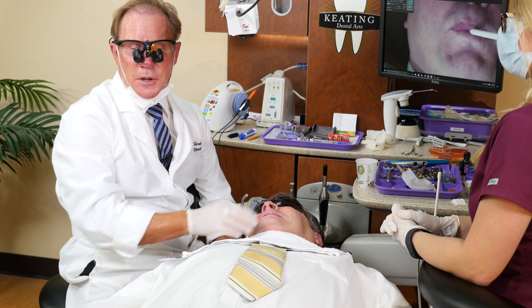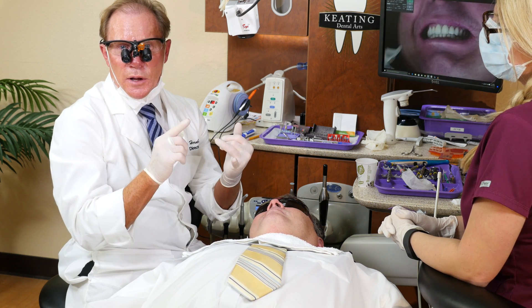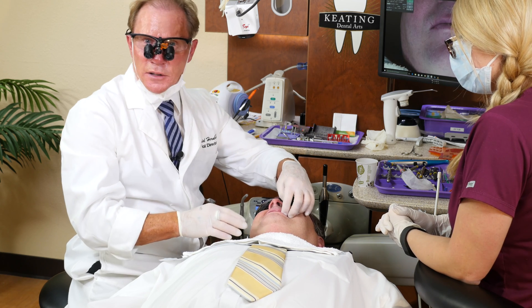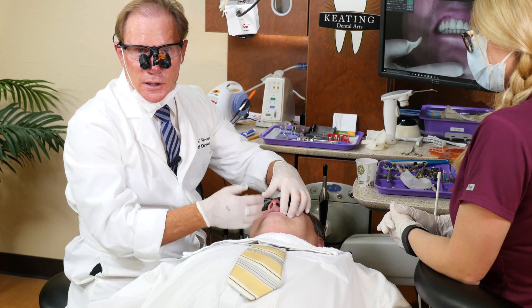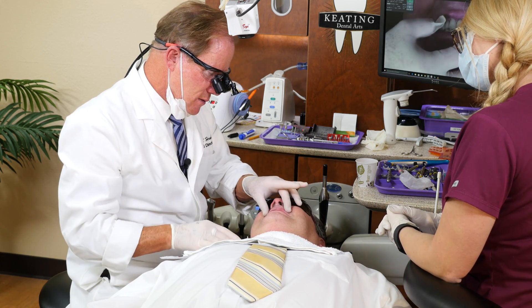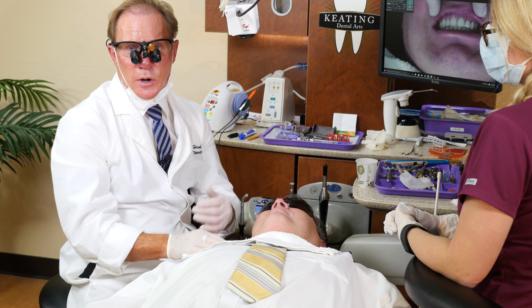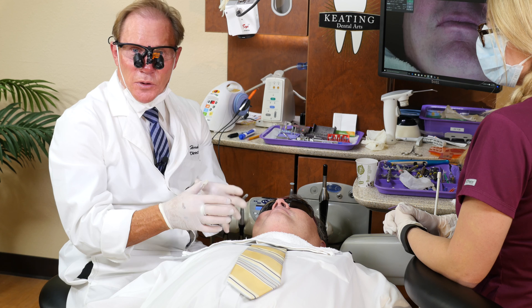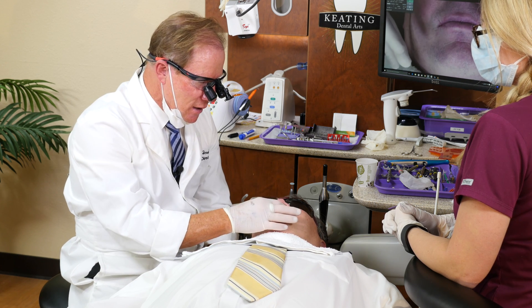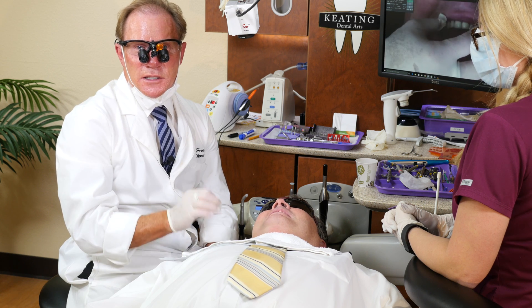As you can see, using digital we're able to eliminate the need for impressions. We can get it to the lab and back much quicker because we don't have to ship it, don't have to pour models, don't have to trim dies — that's all done digitally in a matter of a couple of hours. The mesial contact was just a little bit tight, but we have great occlusal contact, canine guidance, and the aesthetics are great. Next time you take a traditional impression and the patient says they hate impressions, think about digital — or if you're already using digital, be sure to contact us at Keating Dental Arts so we can help make that process as seamless and easy as possible.